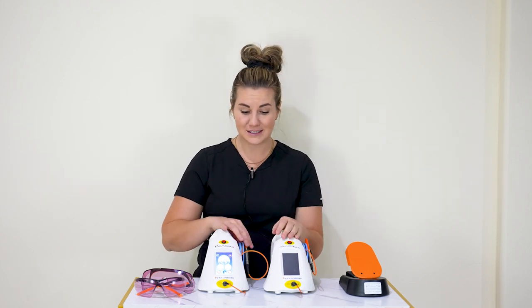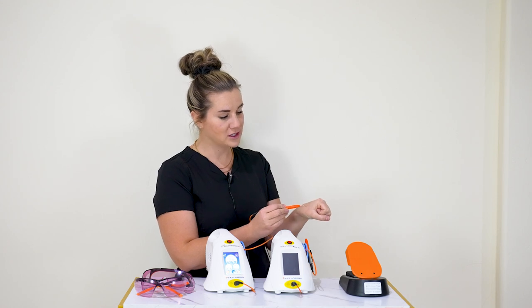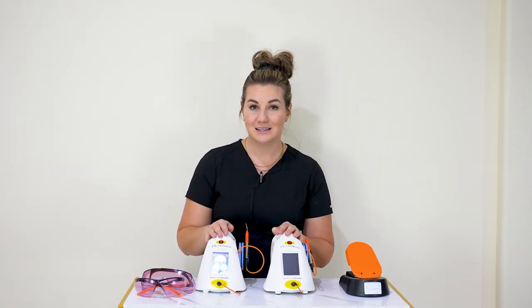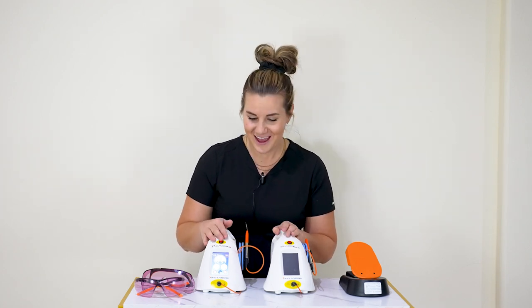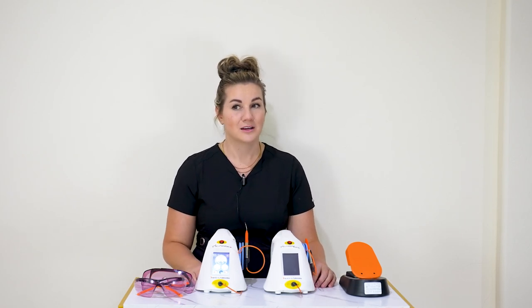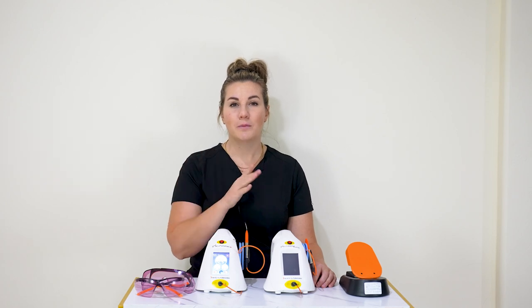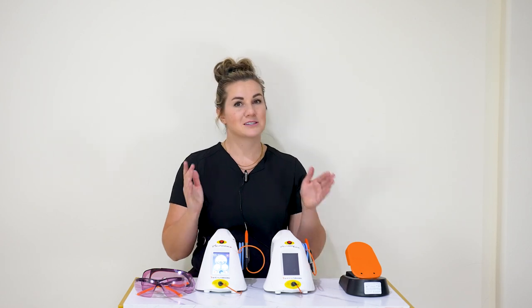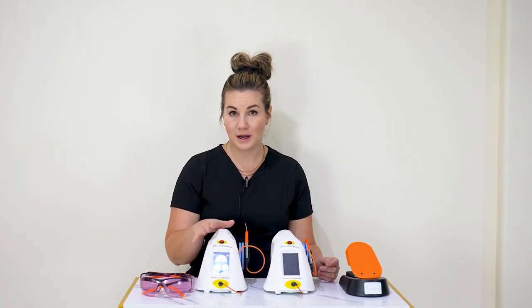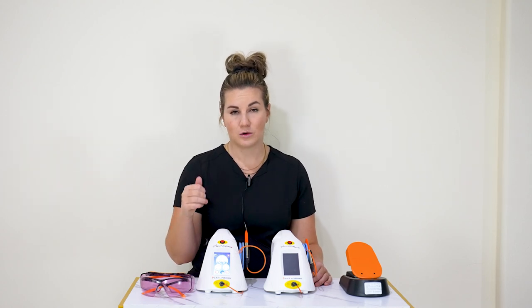Once you find the correct wattage, start the sequence: 30 seconds on, then 15 seconds off. For 30 seconds, stimulate that lesion completely — go around it, color it in, figure-eight pattern — all we're doing is stimulating the lesion; the laser counts down for you. At the end of 30 seconds, let it cool down for about 15 seconds, then repeat. You know you're done when the patient feels numb — use a Q-tip or have the patient use their tongue to check between cycles. Do not go over 5 minutes total stimulation time, as over-stimulating can do more harm.